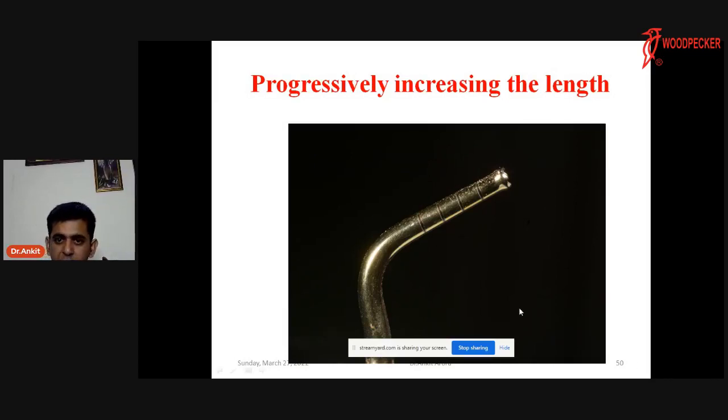The answer is yes. And the good thing is you are very sure at which length you want to cut, at which length you want to drill, because this osteotomy is done by the piezoelectric device. As I have already discussed, it stimulates peri-implant osteogenesis and a reduction of pro-inflammatory cytokines. At the same time, what we have noted is a good concentration of osteoblasts circumferentially in the bone, proximate to the implant, right? So we can successfully say that better periosteal microcirculation acts as an incentive for enhanced bone formation, right?